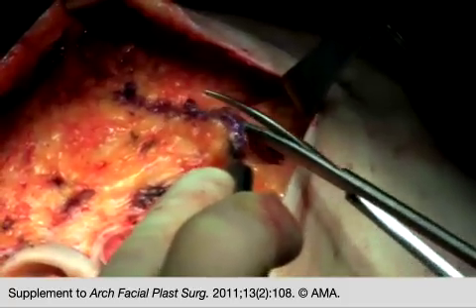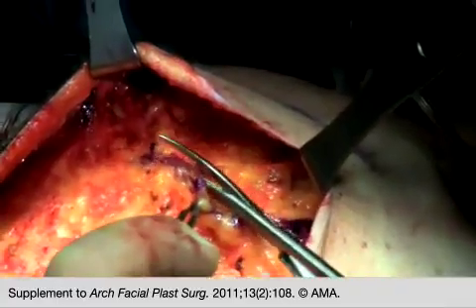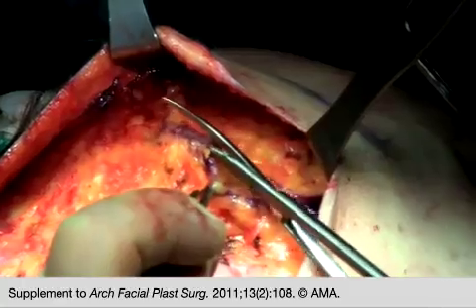The SMAS tunnel is incised by pushing an open scissors through the SMAS tissue. Occasionally, sharp dissection is necessary to complete the incision.